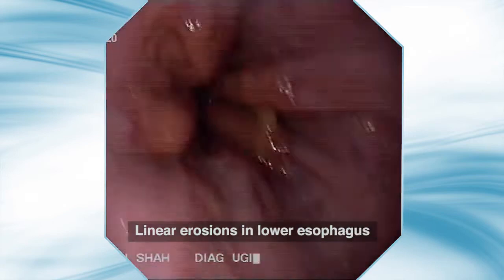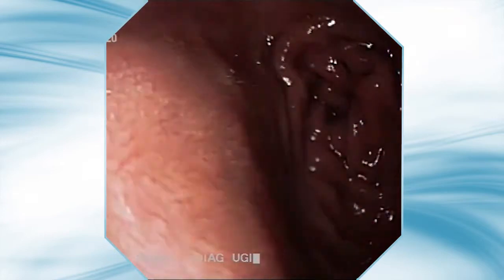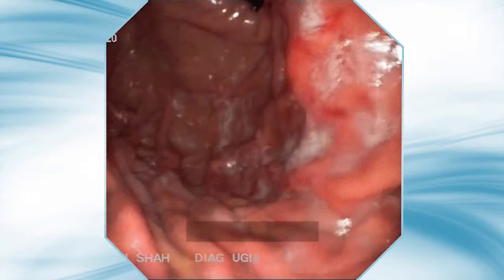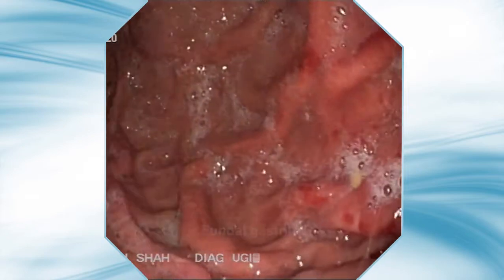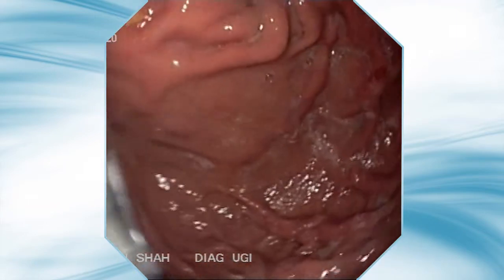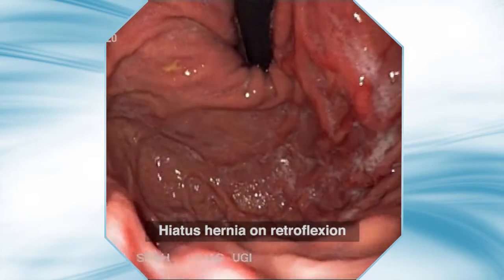Here is another case of mild esophagitis. Severe fundal gastritis is visible on retroflexed view. A small hiatus hernia is also visible.